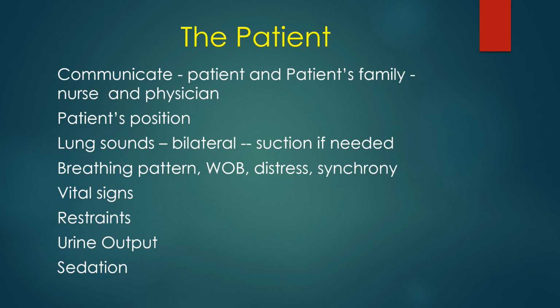You want to look at the patient's position. Is he all scrunched down in the bed? Does he need to be lifted up? Is he way over to one side and kind of stuck down between the rail and the mat? All kinds of things that you see. Also today, we know that patients almost always need to have the head of their bed elevated 30 or 40 degrees. So the nurse may have laid the bed down while she changed his bedding or something like that and didn't raise him back up. So you want to make sure the patient is in a proper position, a good position for breathing and comfort, and not in any kind of dangerous situation.